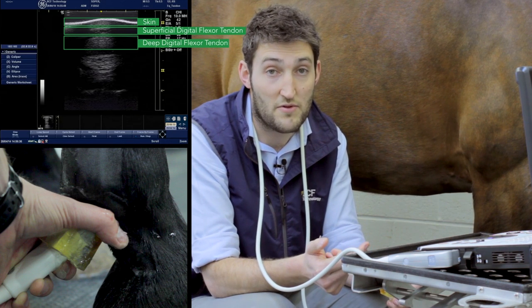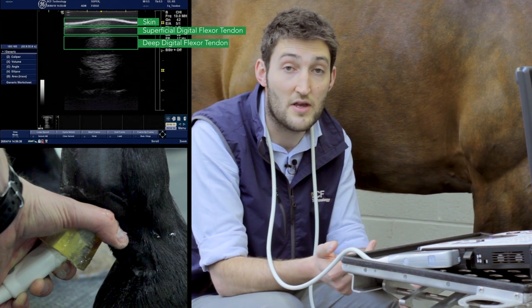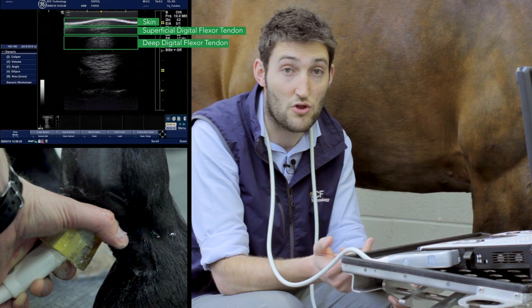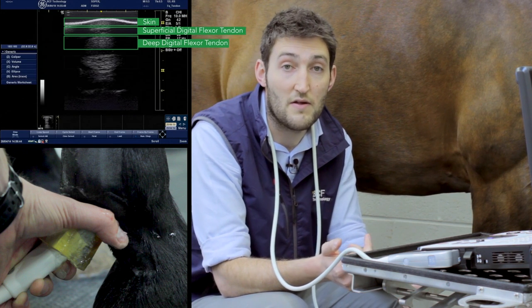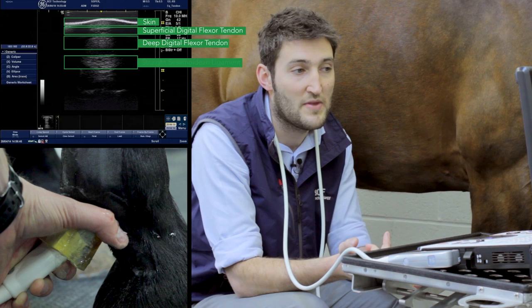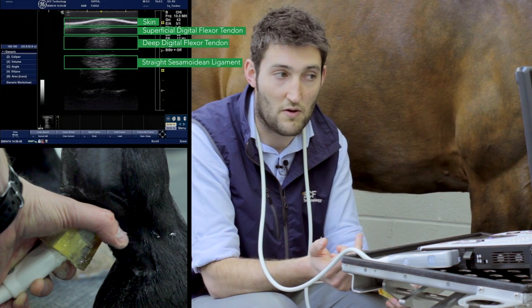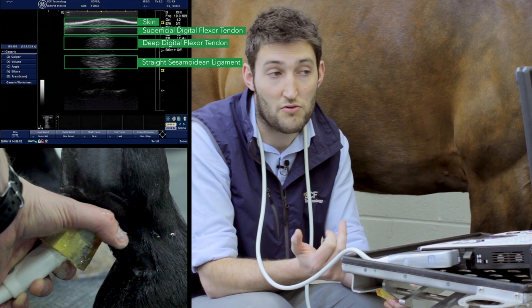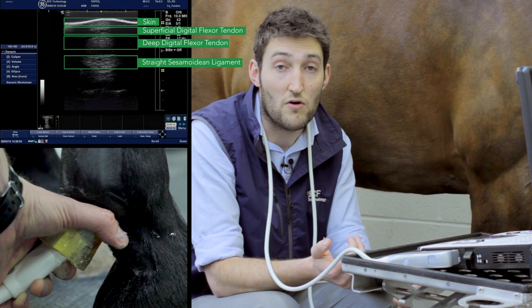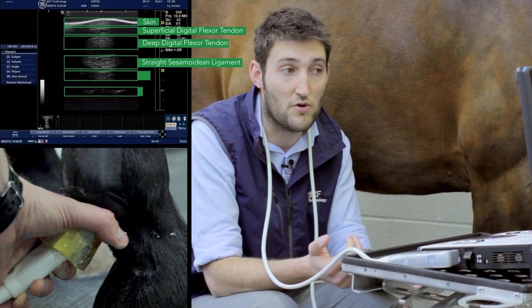Below that, we can sometimes see a little bit of fluid in the digital flexor tendon sheath. And then underneath that, we can see the straight sesamoidean ligament. Much harder to see on the image are the medial and lateral branches or lobes of the origin of the oblique sesamoidean ligament.